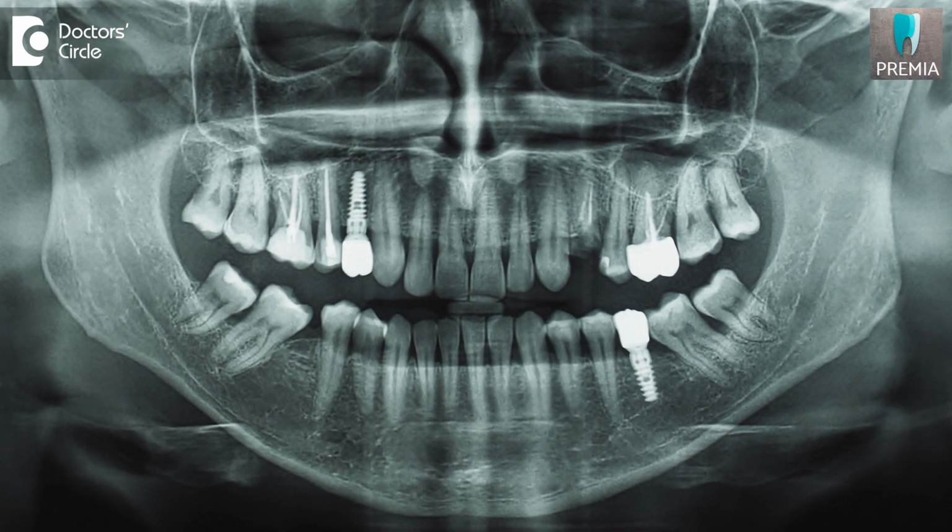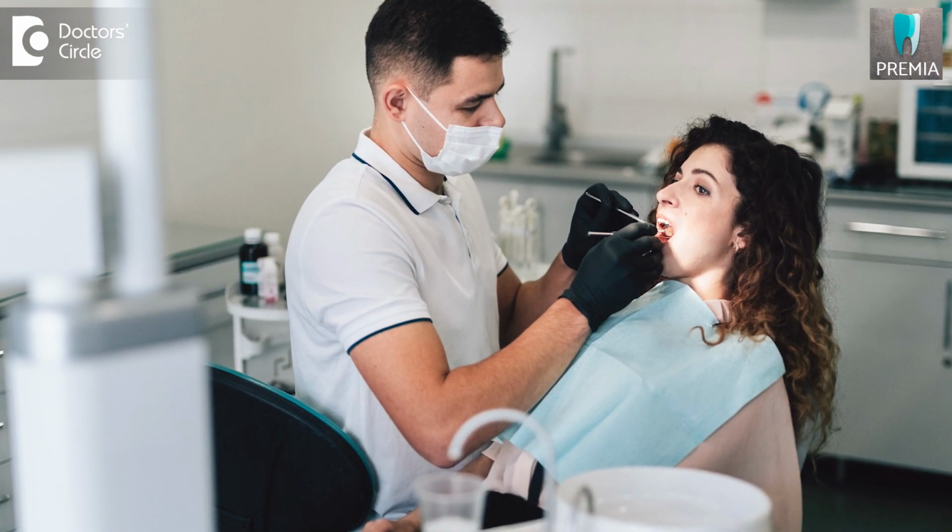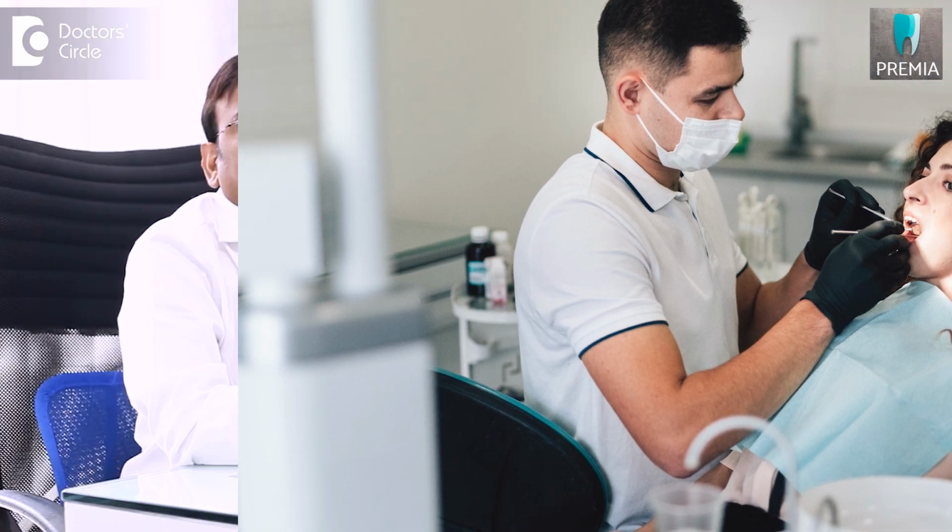Then you call the patient and review, take an x-ray and see if everything is fine, the bone is fine, the occlusion is fine. If everything is fine, then ask the patient to come and review after every 6 months. So the review portion of the implant crown is very important. You can call the patient after a month, then after 6 months, and at least once in a year, the patient should come for a review.